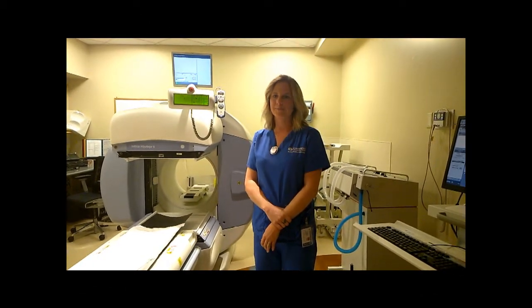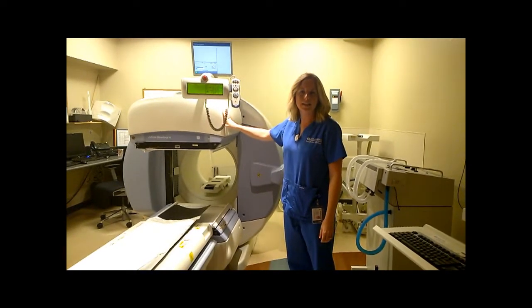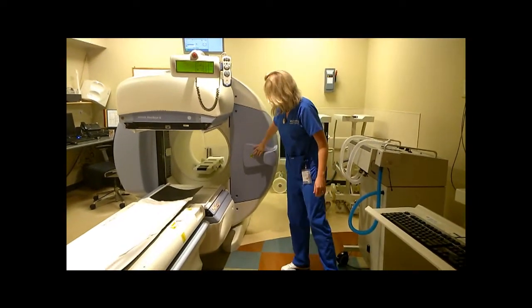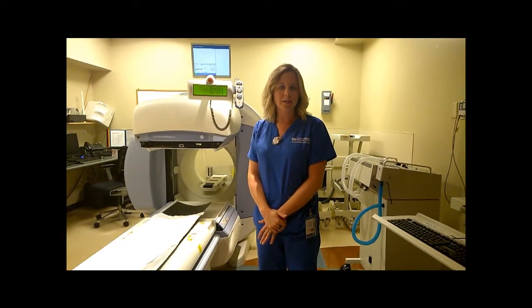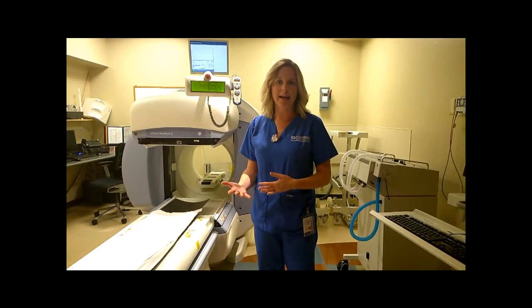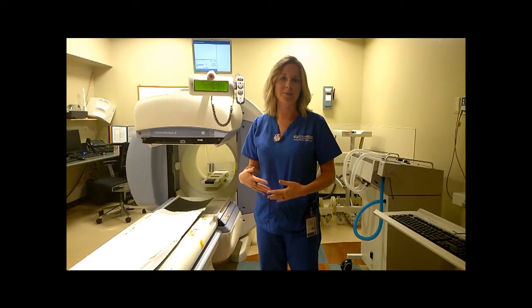Hi, my name is Danielle, and I'm going to demonstrate how to set up for a SPECT CT acquisition. This is our nuclear medicine camera, but this one actually has a CT as well, which is right here at this part. We use SPECT if you want to get a 360-degree view of the anatomy that we're looking at. When you add the CT portion on, you can actually see the anatomy and fuse those images, which allows for the greatest localization if you're looking for something really specific.